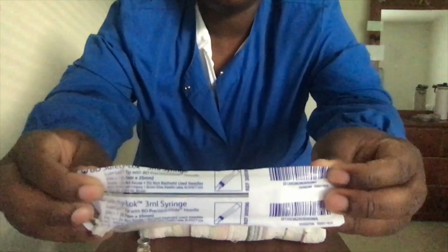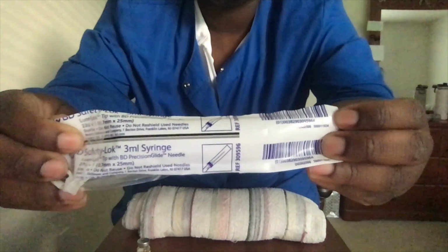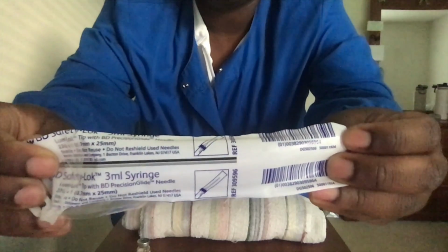In this case, I have chosen a 3 milliliter syringe with a 22 gauge 1-inch needle. This is sufficient for the deltoid site, given the parameters I just stated. I will also need an alcohol pad. Now that I have my materials, I can go ahead and do my second set of 6 rights.